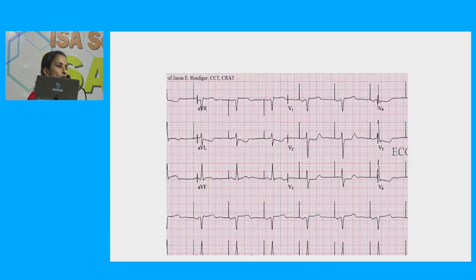So how does the ECG look in a patient with a pacemaker? This ECG shows sharp pacing spikes before the P wave, and the QRS is of normal morphology. We can interpret both QRS and T waves. This ECG has a normal PR interval, so it is suggestive of atrial pacing.